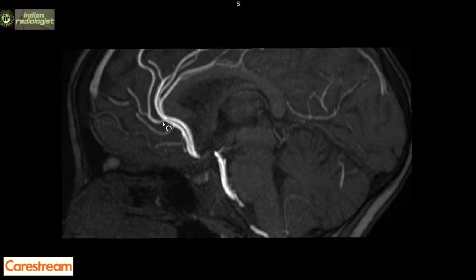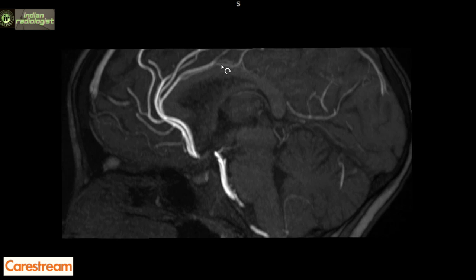The callosomarginal artery runs through the cingulate sulcus and gives rise to the internal frontal branches. The pericallosal artery is the continuation of ACA beyond the origin of the callosomarginal artery. We can see our pericallosal artery here, which arches over the genu of the corpus callosum and goes posteriorly over the surface of the corpus callosum. It can go as far posteriorly as the splenium. The cortical branches of the ACA anastomose with those of the MCA and PCA.